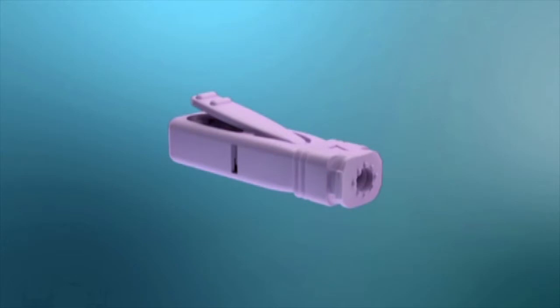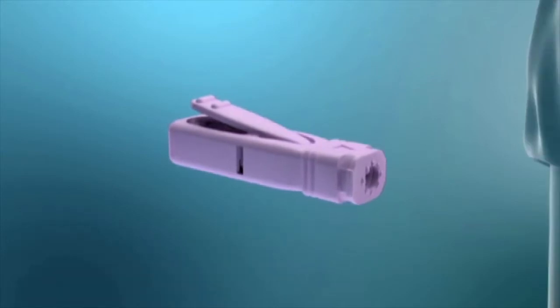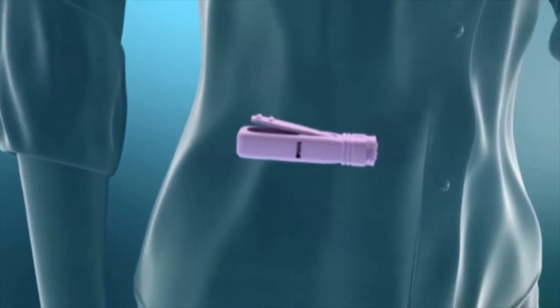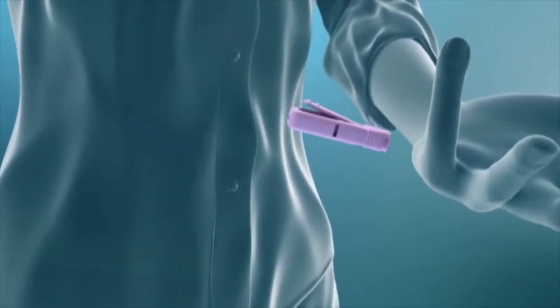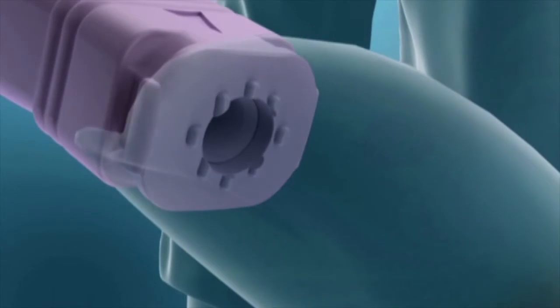Based on the gate theory by Melzack and Wall, painful stimuli can be masked out by the counter-introduction of non-painful stimuli.